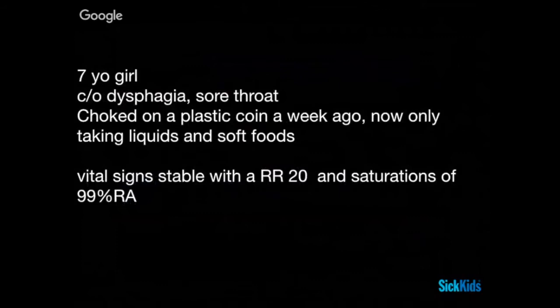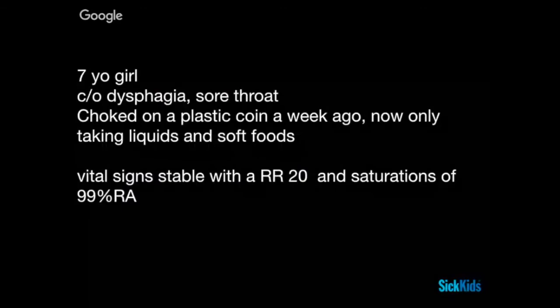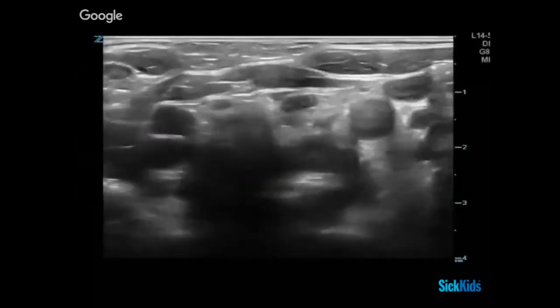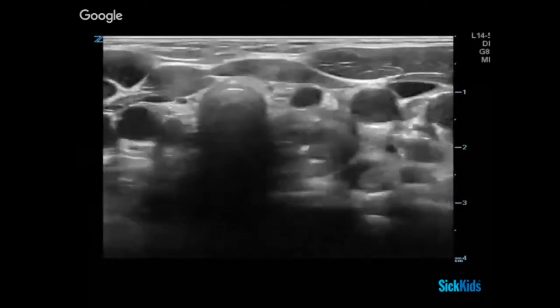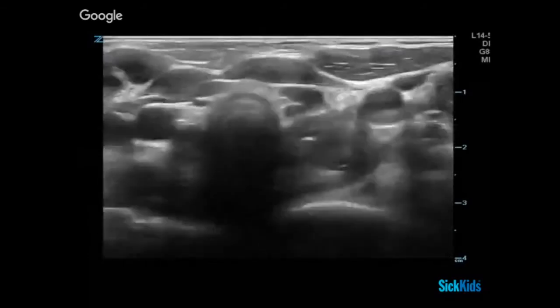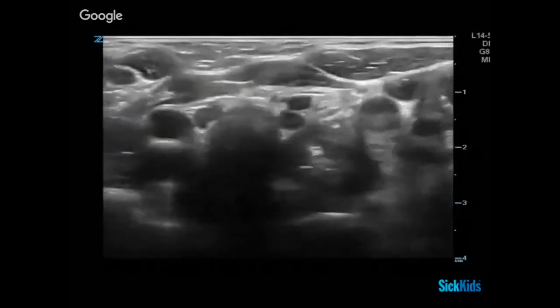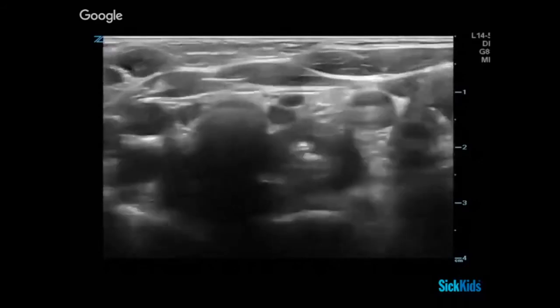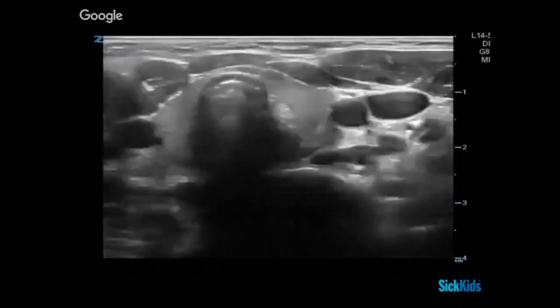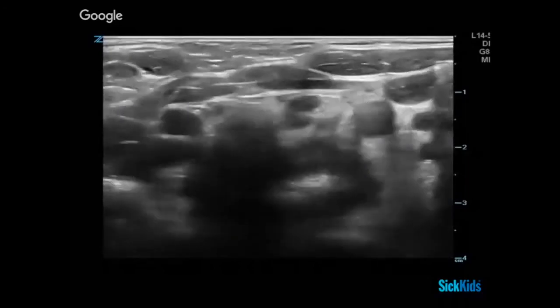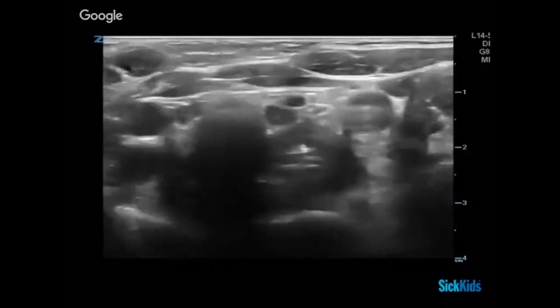Our case is a seven-year-old girl complaining of dysphagia and sore throat after choking on a plastic coin a week ago. She's only taking liquids and soft foods but has stable vital signs with a normal respiratory rate and saturations of 99%. We took a quick look at her upper esophagus, remembering we won't be able to see deep to the clavicles. As we roll through this clip, you can appreciate the trachea as the large circular structure on one side, and then a large caliber, stationary esophagus that seems to have something inside of it on the other side.